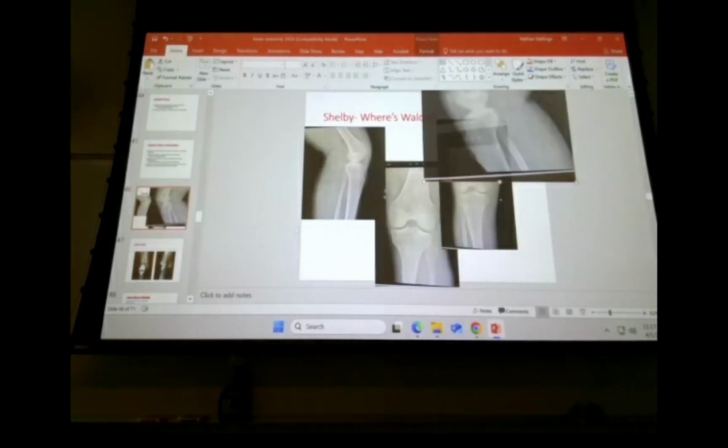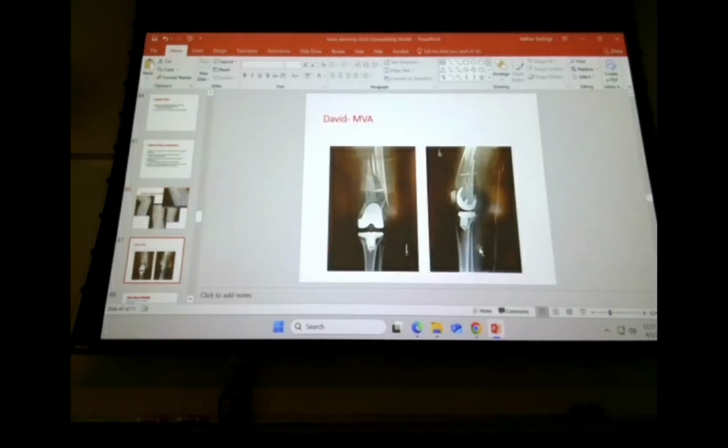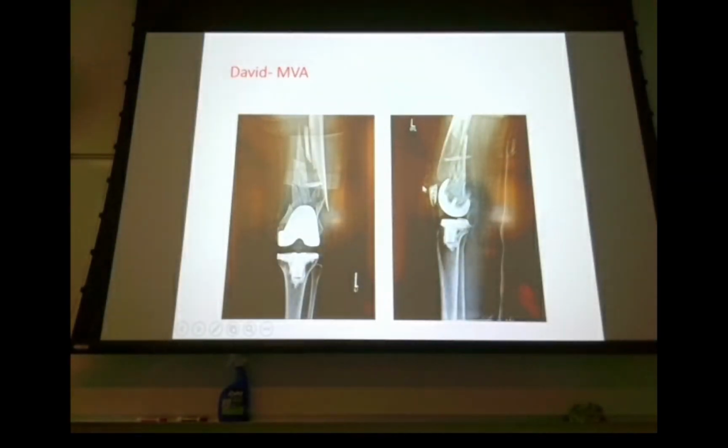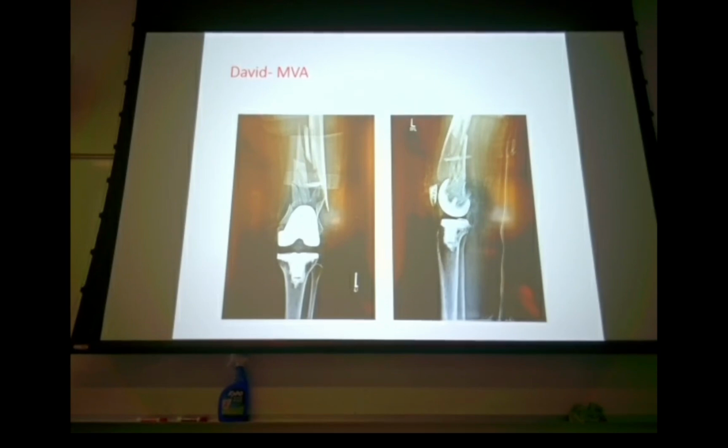So, anyway. Then David gave us this. That's just nasty. Again, a car wreck, right? Yeah, that's a pretty good one. Dashboard came back and smacked it. Yeah, I've never seen a femur like that. I don't think I have either. I mean, y'all sent me some crazy stuff, which I appreciate. I guess the only thing they could do for this patient is external fixation.